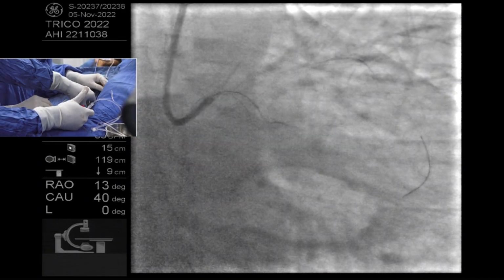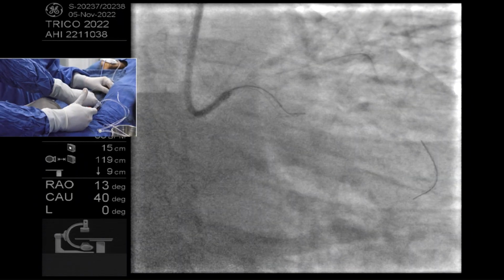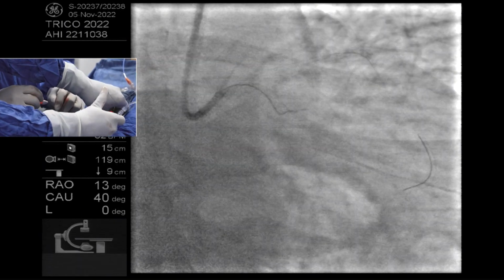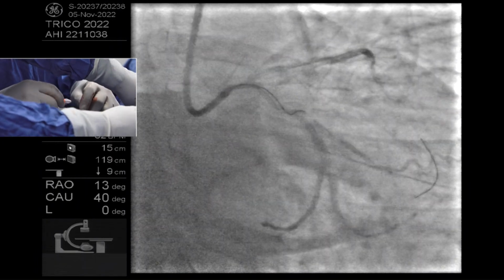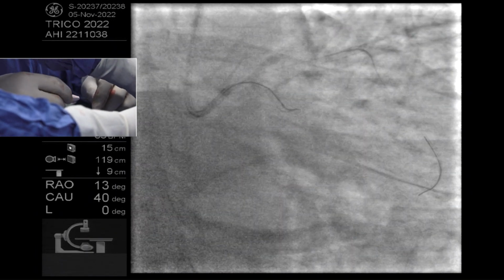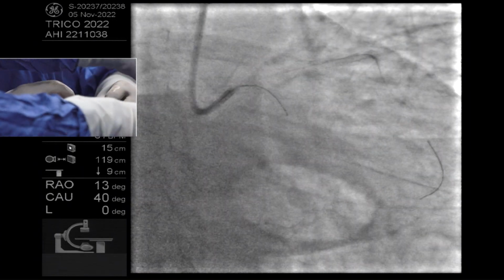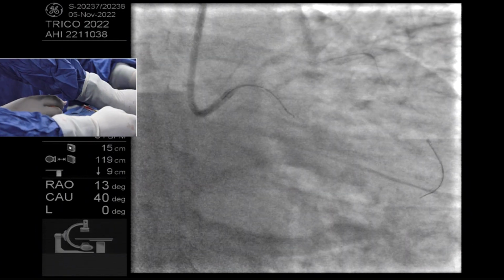So I think he's doing what you guys were suggesting, which is try and bring the MC up to the ostium. I think Dr. Saito's skill is demonstrated here. Most of us would have prolapsed the wire 20 times by now. 25, so. I agree. That's an extremely challenging maneuver to do, yeah. Very difficult. Dr. Saito, do you think a thrombus aspiration catheter works as a dual lumen catheter? I don't think so.